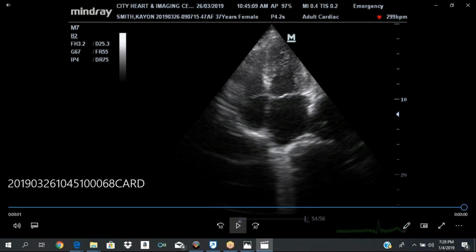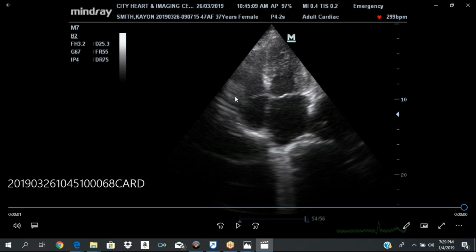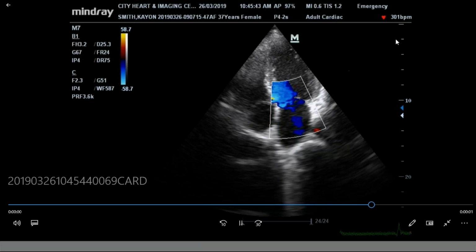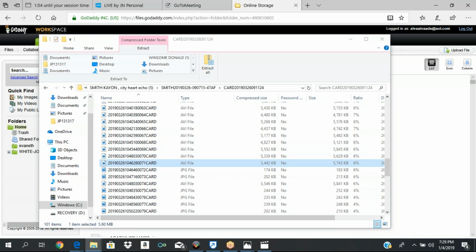Your marker is towards the 4 or 5 o'clock position. So again, the probe transducer is at the intersection between the mid-clavicular line and the apex of the heart, which is about the fourth, fifth intercostal space. Okay, and this is the image you're supposed to get. Heart standing straight up. And we put color in everything. We're looking for abnormal flow.